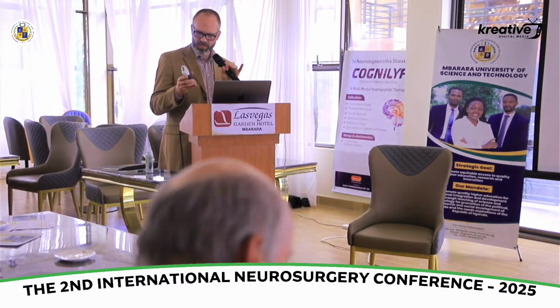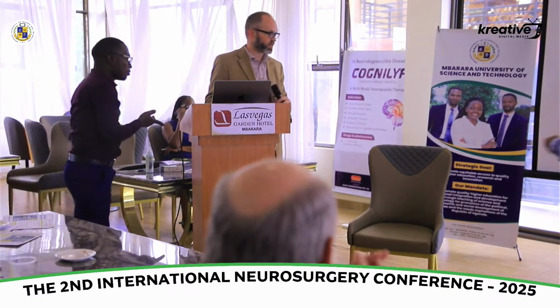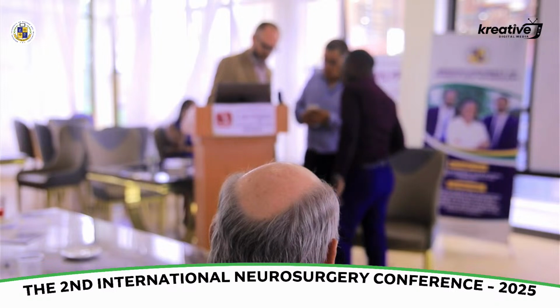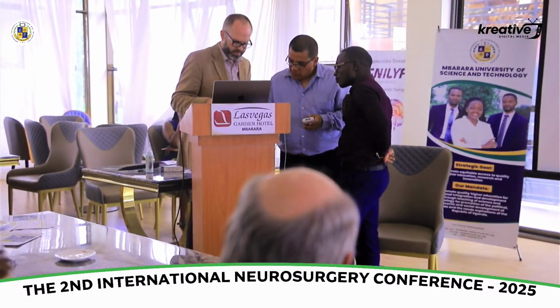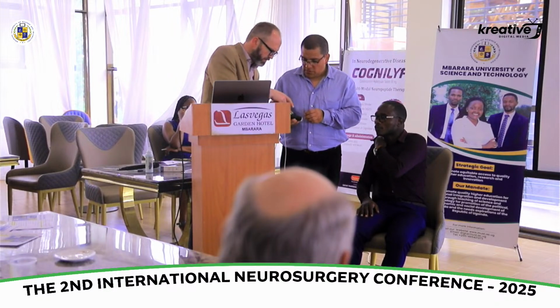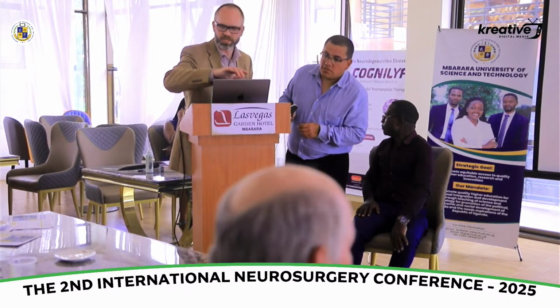So Joseph, you can come up here, take a seat. You have to control it from my phone. So the controls are from the phone. All right. So B mode, and you can do color, power Doppler, or pulse wave. Let's start with B mode, and you're live right now. You can press the button there, not the power button, but the other one that freezes or unfreezes it. Okay. You have gel? Where did the gel go? I had a whole bunch of gel.